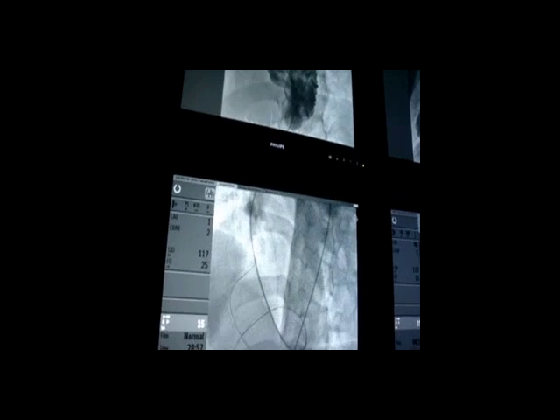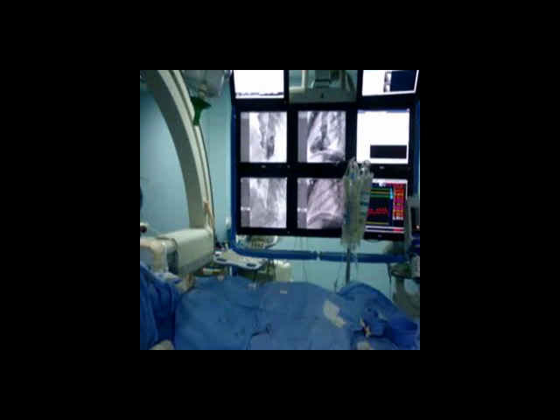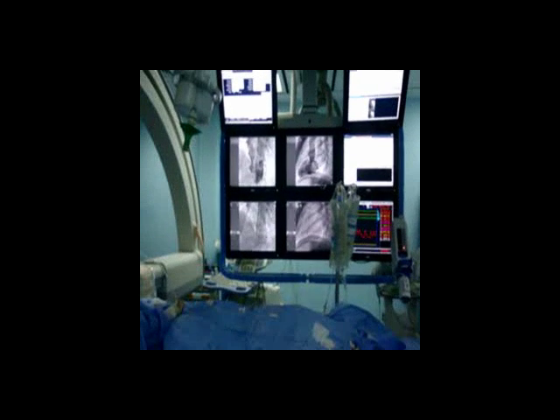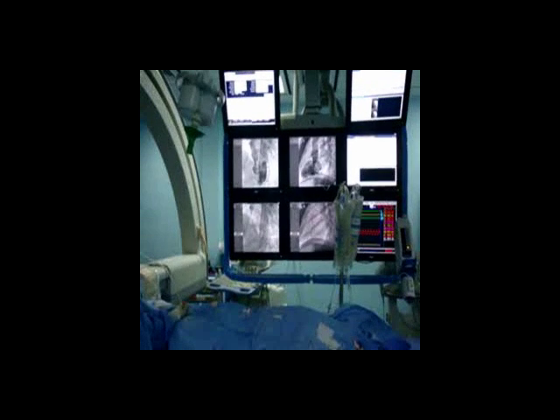We advance the wire more in the RV, and as you can see, it went up actually to the pulmonary artery. So the wire is crossing the VSD to RV and then to MPA. As you can see, the wire is going up, up, up to the pulmonary artery.